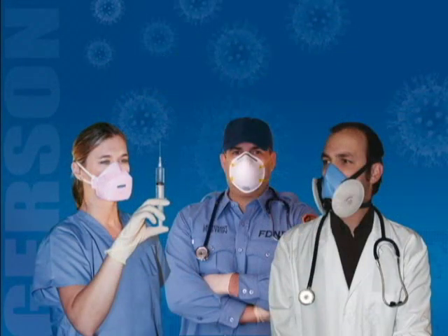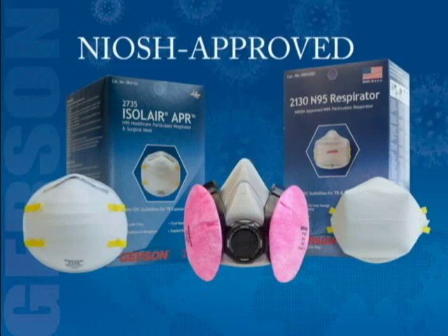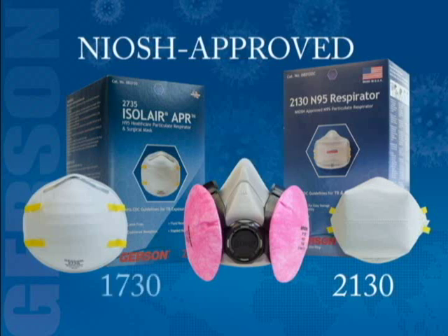This video demonstrates the qualitative fit test procedures for NIOSH/TA approved Gerson surgical respirators such as the Smart Mask model 2130 and molded respirator models 1730 and 2735, among others.